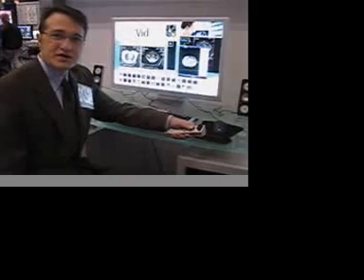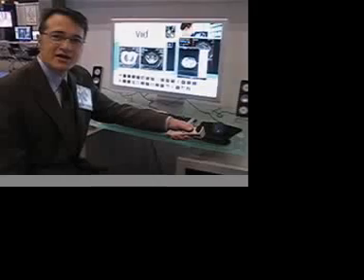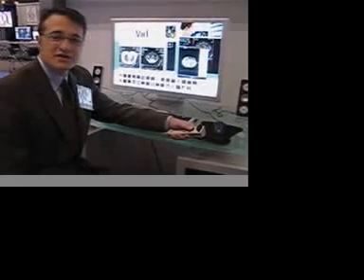Another factor is that you can easily create teaching files with this, pull them into PowerPoint and email, and even in your own teaching file. So I'll show you how this works.